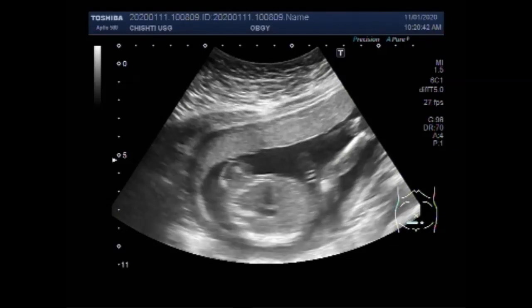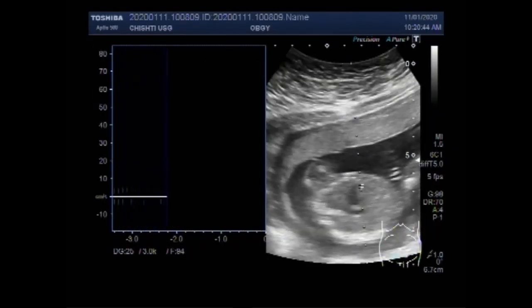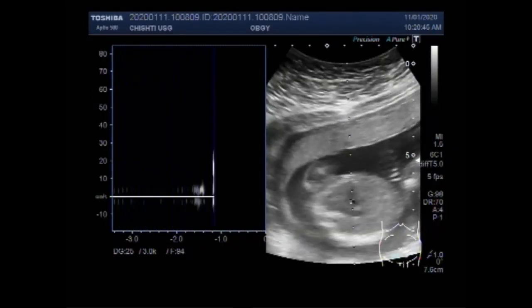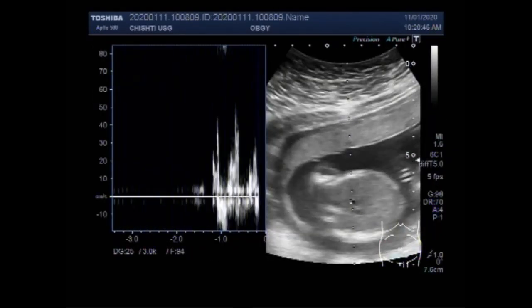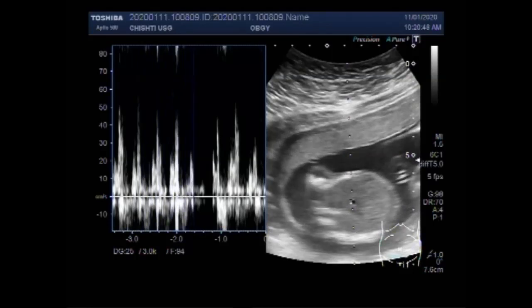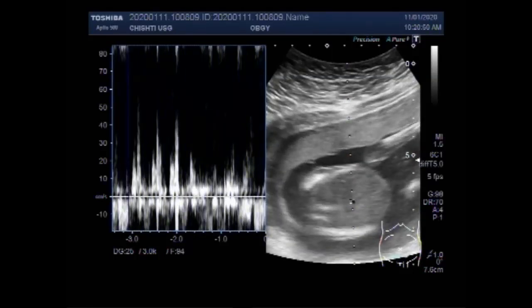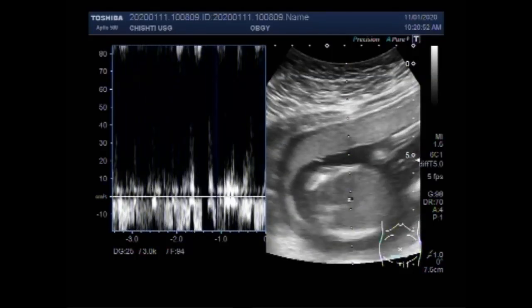You can see this is the fetal cardiac activity, and fetal cardiac activity is visible and also audible.